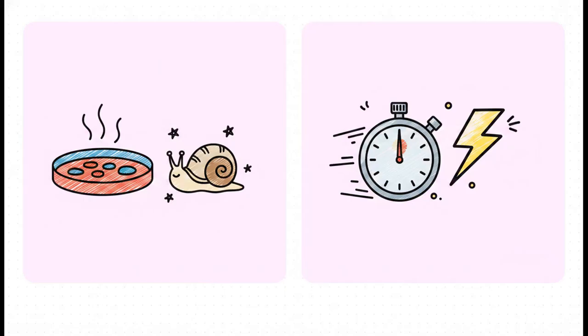Because we rely on process evidence, we basically have two main avenues for product release. First up, microbiological release. This relies on incubating a biological indicator, a BI, placed inside a challenge device. It gives you direct evidence of microbial kill, sure, but it's slower because, well, you have to wait days for incubation. It's really common in routine EO, for instance.